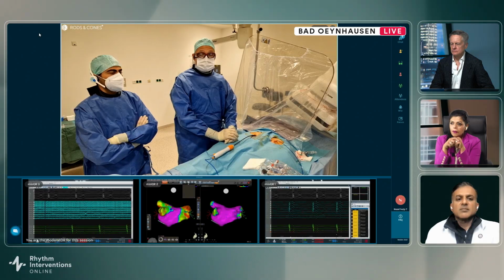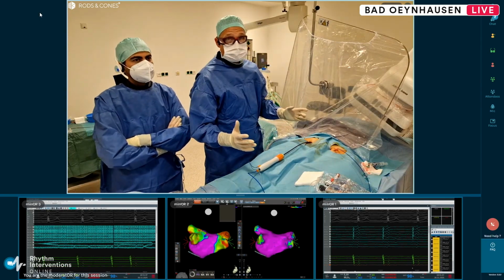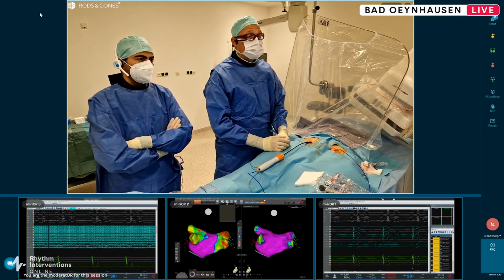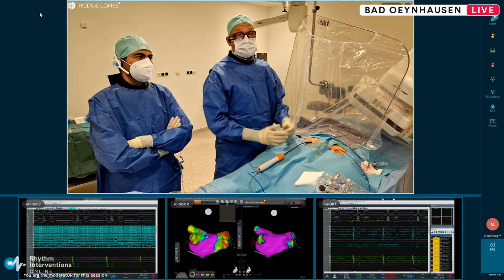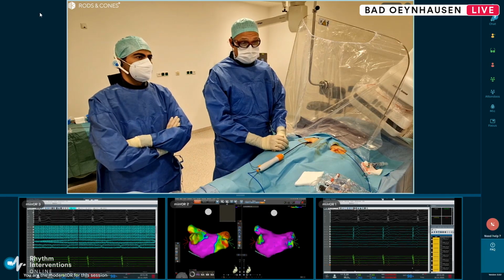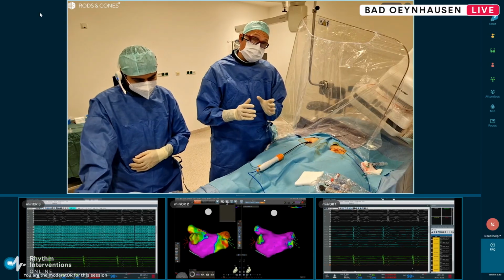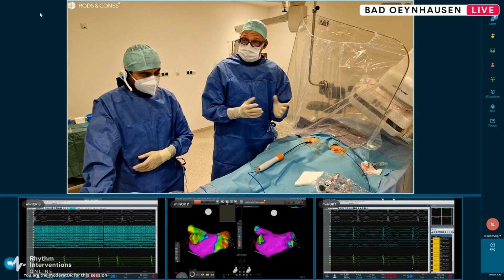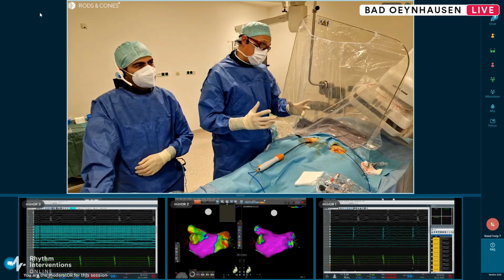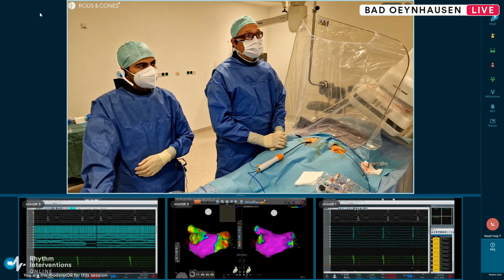Yeah, so normally from the data we just have, let's say, 4 to 5 additional applications. So we try to do as little as necessary. But we never observed in our hospital these kinds of more than 100 lesions. What we know from the literature is that the problem may start when we have more than 70 lesions, which is also almost never the case for us. So staying with these, let's say, 16, 20, 24 lesions, we have not observed it.